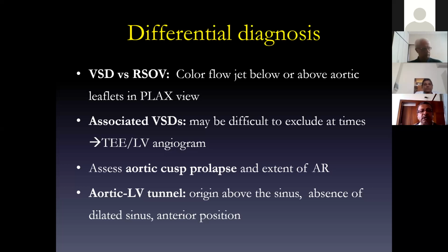A continuous wave Doppler, that means it's only a systolic wave, it is a VSD. Associated VSDs may be difficult to exclude at the time of echo, so we need to differentiate, or we need to have the associated VSD delineation in the TEE or the LV angiogram. Even then, TEE of course will give a very nice picture of the VSD, no question about it. So the LV angiogram may be necessary at times, but all these things would be planned before doing the procedure.